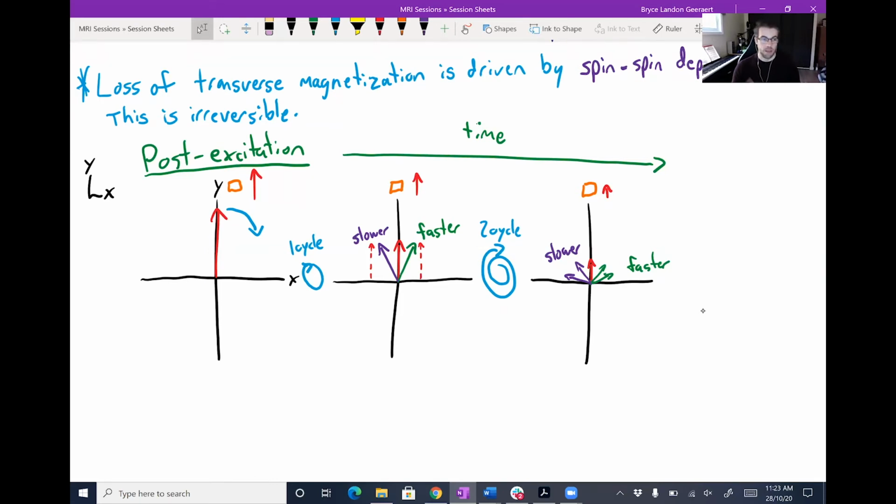So that essentially means that these very small local fluctuations in the magnetic field are present all the time, everywhere, and the physics behind MRI is never perfect enough to have every hydrogen atom experiencing the same magnetic field, right? So dephasing happens immediately, whereas you need to allow more time for hydrogen atoms to get rid of their energy, instead of passing it off to another hydrogen atom, and actually get it out of the system to the background lattice. So that's the main reason that T2 effects are so quick.